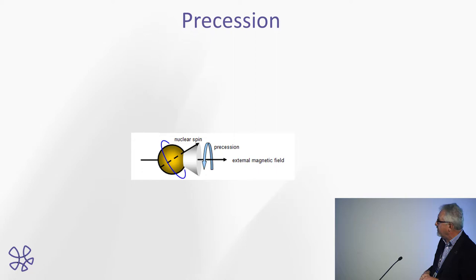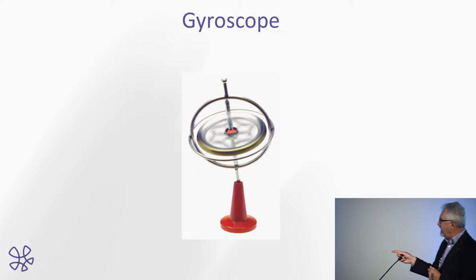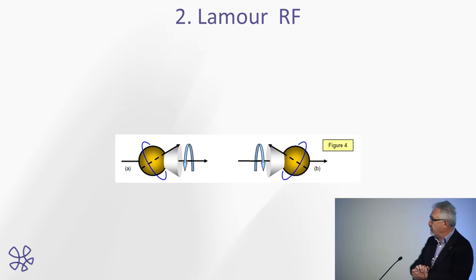The Earth precesses as well. Lots of things precess. It's to do with chaos theory, I think. But anyway, we precess, and precession is important because there's our gyroscope, because we can precess one way or the other. So here, one of them is the 100, well, the 99 normal people, and one is the oddball, the one we want. And if you make him precess, you can hit him with an RF field, a radio wave, and he flips. And it's that signal when he flips that gives us the whole of the MR image.